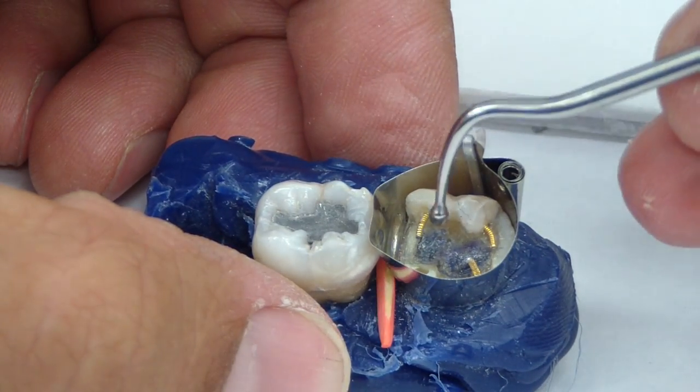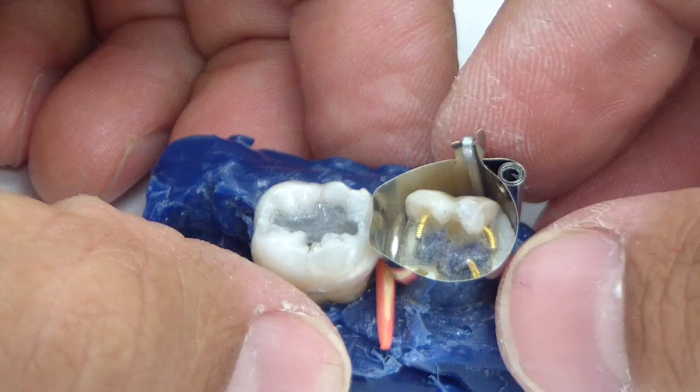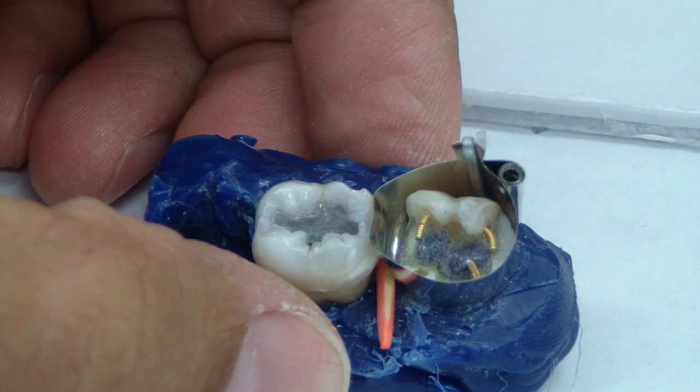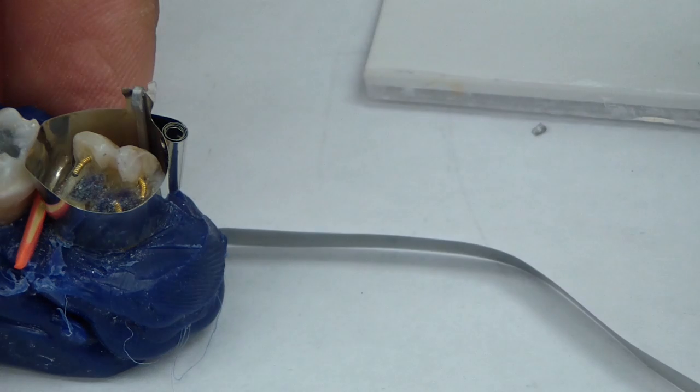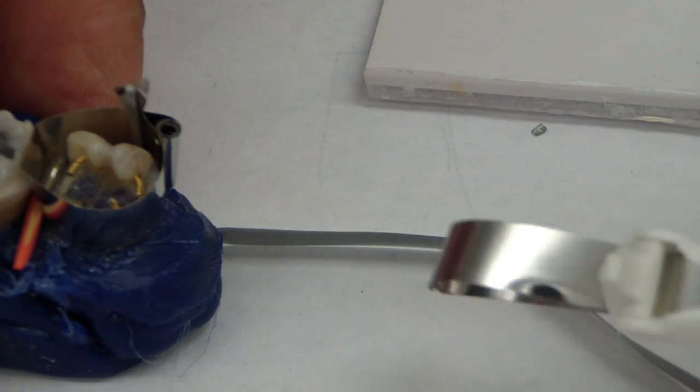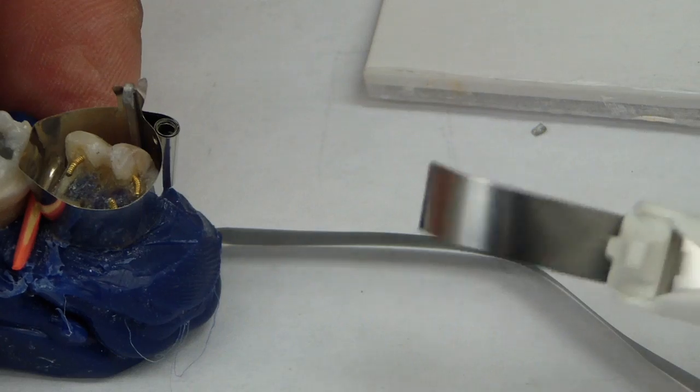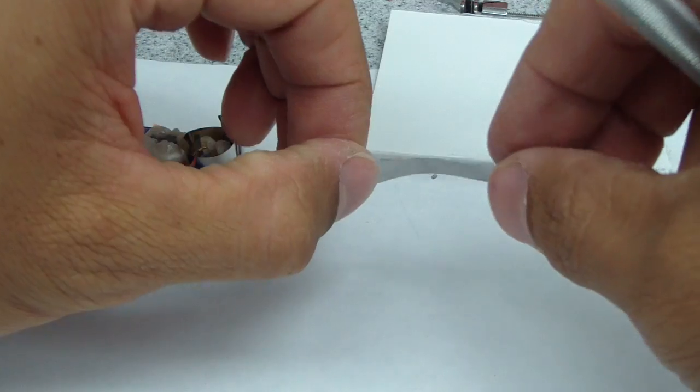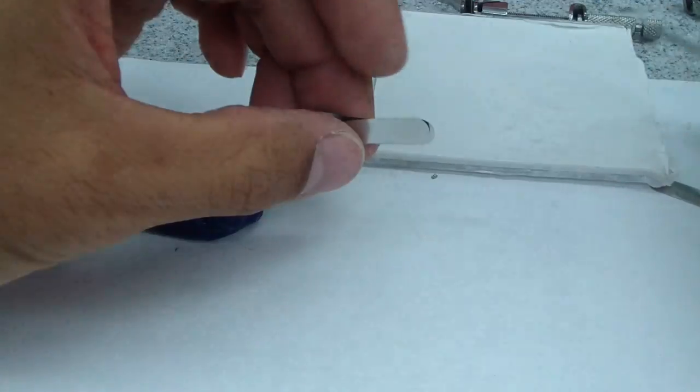And often, what we do, and this is with any stainless steel matrix, whether it be auto matrix, whether it be with Toffelmeyer, unless it's pre-contoured, or even omni matrix, unless it's pre-contoured, these are all flat, essentially when you go to place this band intraorally onto your tooth after you place it into your matrix system.